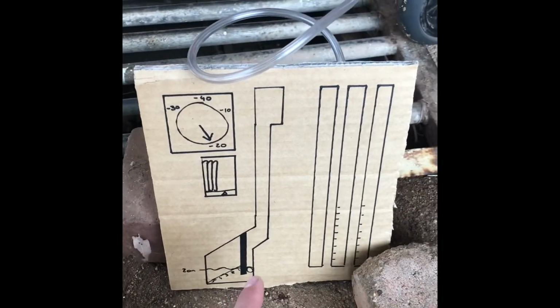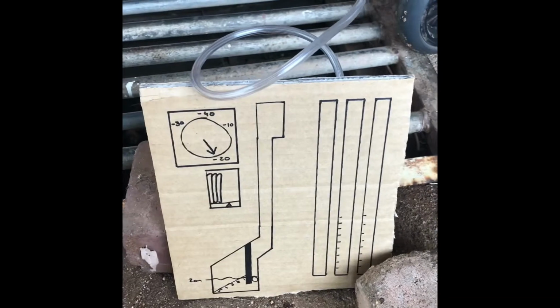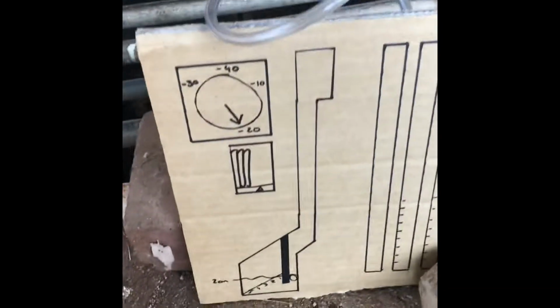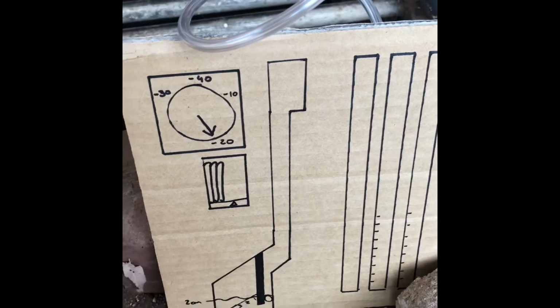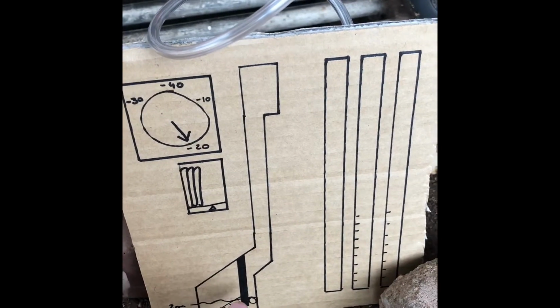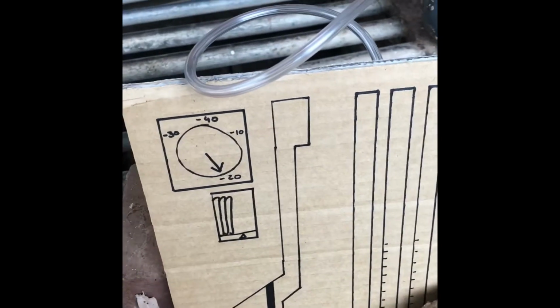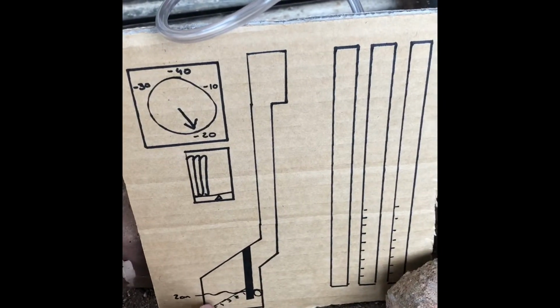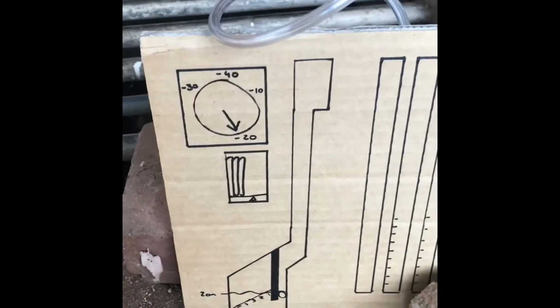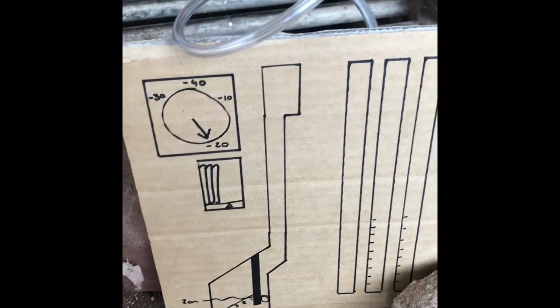We might note some bubbling if the tube has been inserted for a pneumothorax. We might note a small amount of bubbling at the end of the respiratory cycle. There are numbers here from 1 to 5, and that helps us describe the intensity of the bubbling. If the bubbling is coming up at the 5, then that will be a large amount of bubbling.